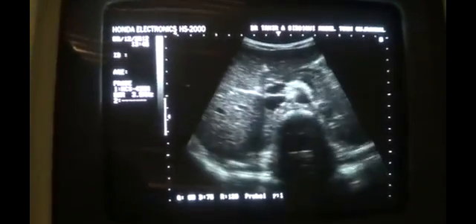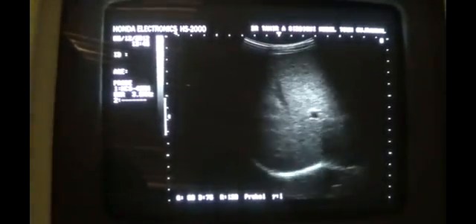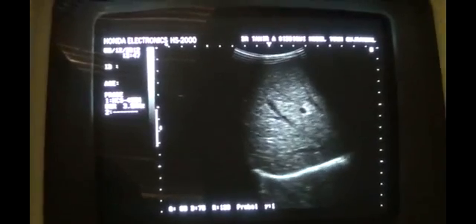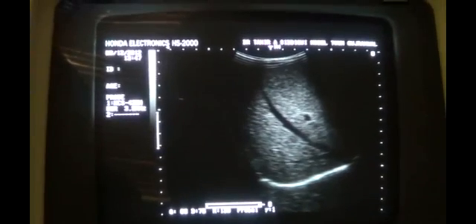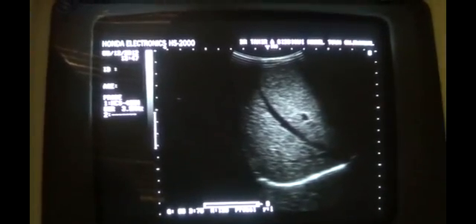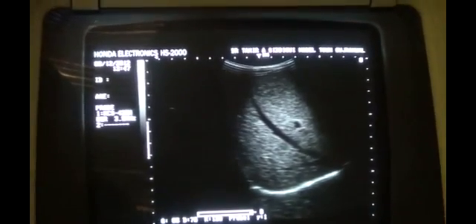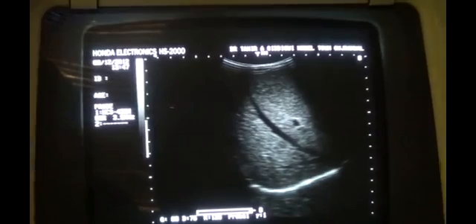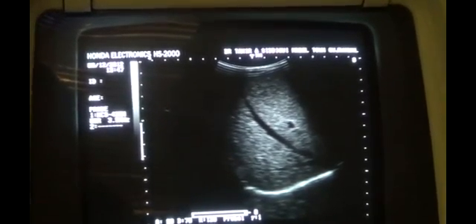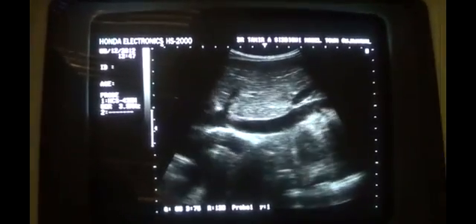So the liver is normal, but despite being normal, it is being seen below the costal margin. So be careful not to give it as a pathology. Don't give hepatomegaly in such cases. Always say that although the liver is seen below the costal margin, the rest of the sonographic liver parameters are within normal, because of the age of the patient, number one. Number two, because of the thin, lean stature of the child or the patient you are studying.